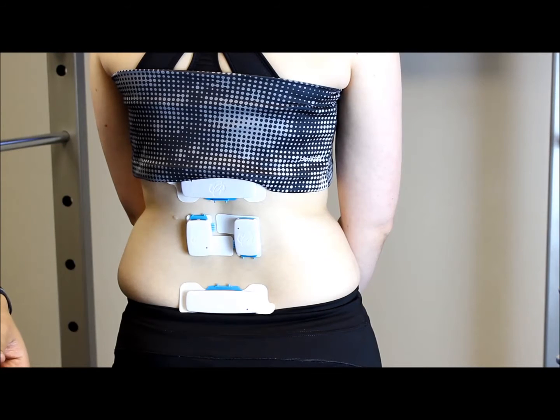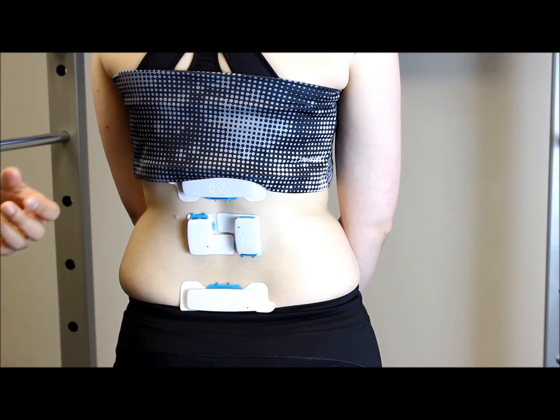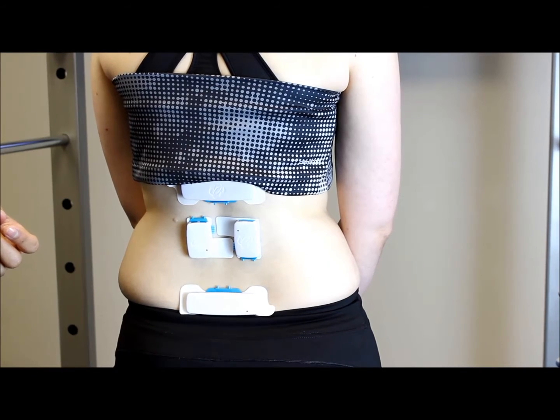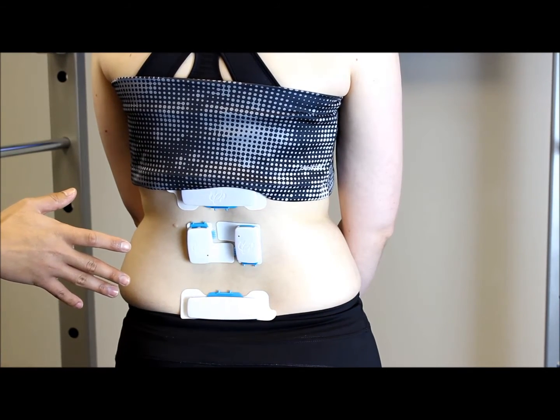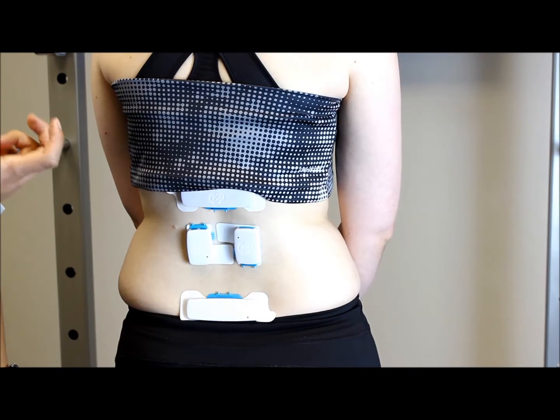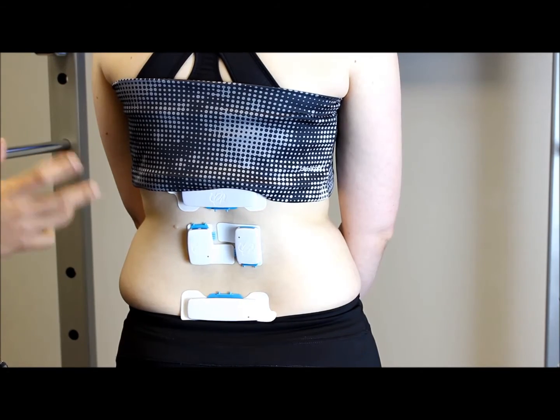The EMG sensors measure how much muscle activity is going on when you're doing the movements. With these two bits of information we can create an exercise program that's tailored specifically for the way that you move.